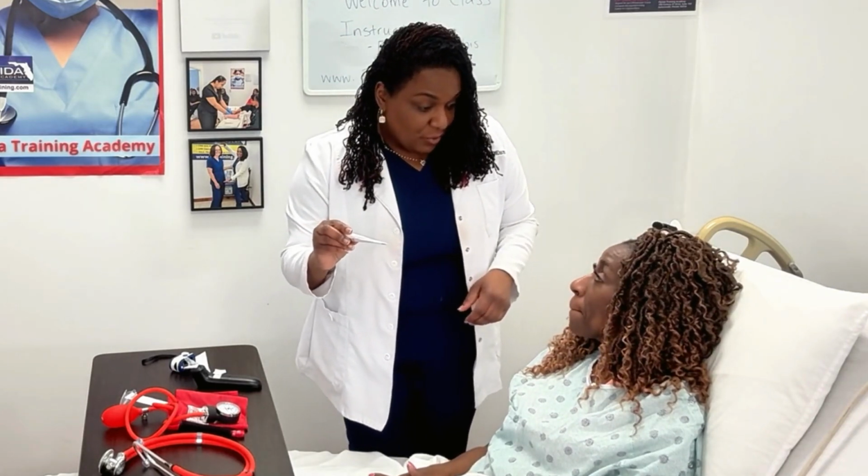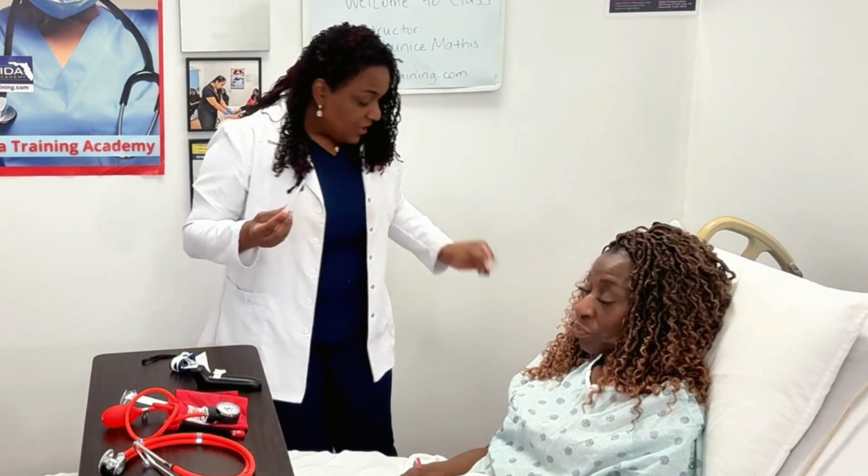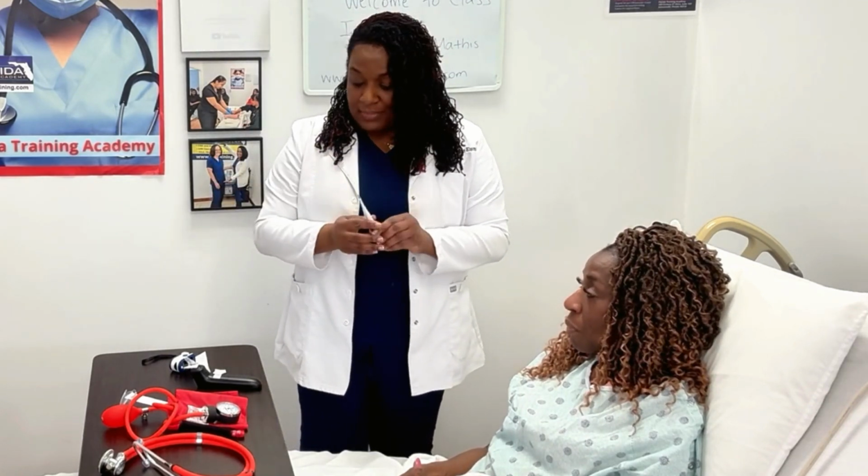Mrs. Loretta, I'm sorry it's taking so long, but it should be finished reading soon, okay? Mm-hmm. And that's what you're waiting to hear. Miss Loretta, your temperature is 97.8, which is normal for you. Do you have any questions? No, ma'am. Remove your probe cover. Turn off your thermometer. If you have an alcohol swab, of course you can wipe it. I know Miss Loretta personally, so I don't have on gloves. But in your facilities, especially if you're dealing with the mouth and oral secretions, make sure you've done proper hand hygiene and wear gloves when you're taking someone's temperature.